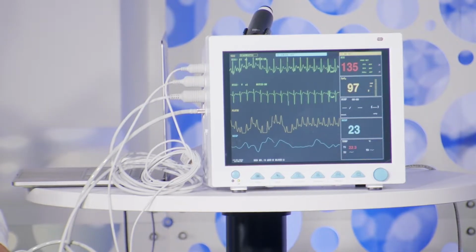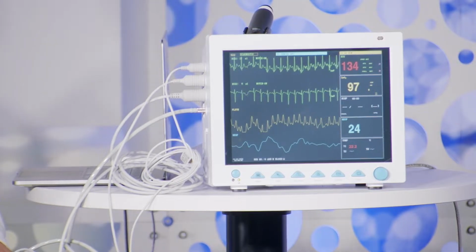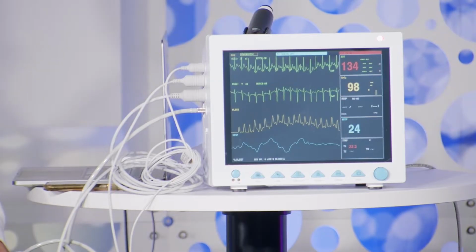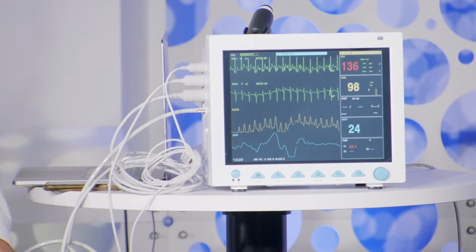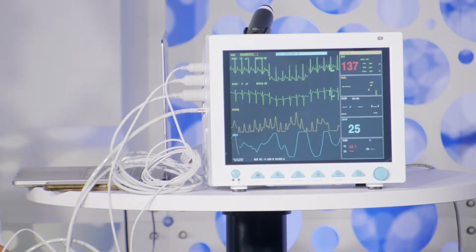As you can see now, the mode that the device is running is normal. You can see it because the button flickers. And you can see that he's nervous, okay? Everything here is reading correct. Everything is real. We were very nervous that he would not be nervous, so good work, Sharon.